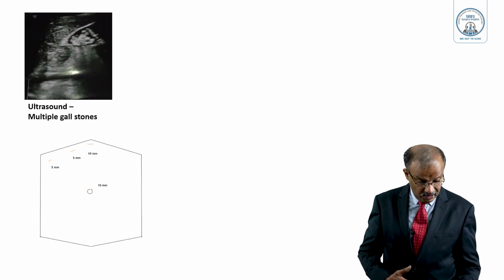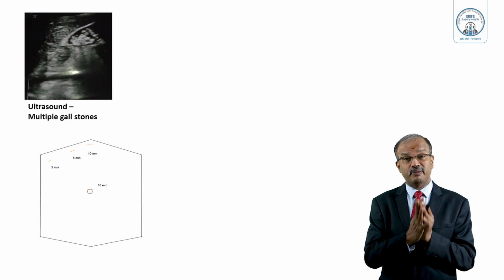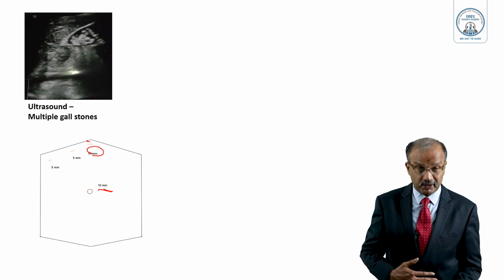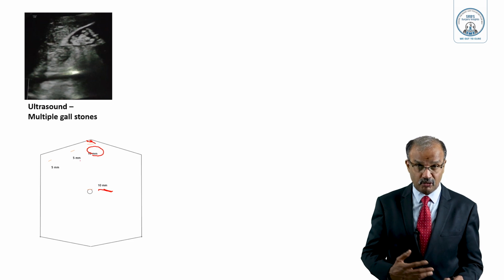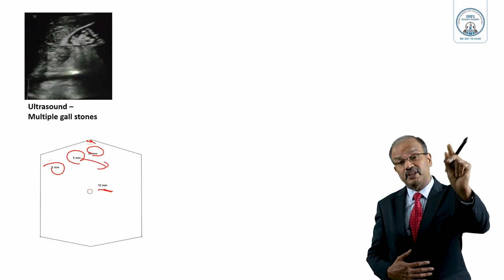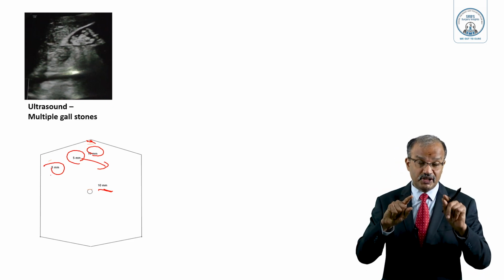See that laparoscopic port placement diagram, they will ask. MCQ they will ask, so you should remember. OSCE they will ask. So this is the 10 mm port for the camera. The 10 mm epigastric port here is for dissection and retrieval of the gallbladder specimen after cholecystectomy. This is the 5 mm port for dissection. This is the 5 mm port mainly to hold the Hartmann's pouch. The 5 mm port holds the fundus of the gallbladder, to retract the gallbladder above, so that the dissection will be crucial. Calot's triangle will be visualized by holding this lateral 5 mm port.